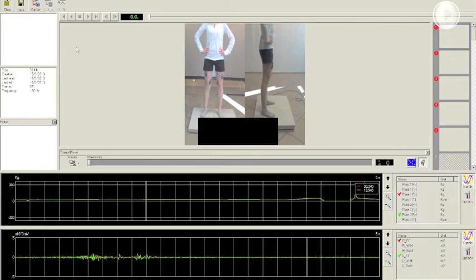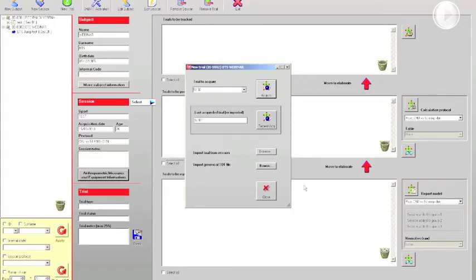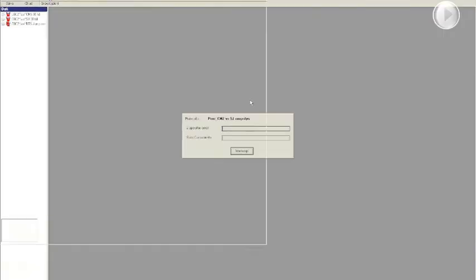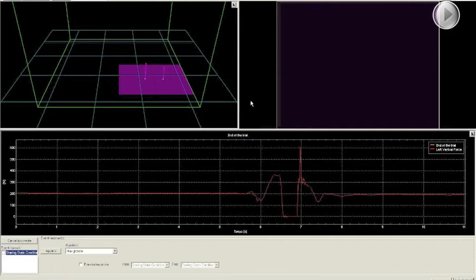And here we are. We close the tab to acquire new trials, and here you can see that we have our counter movement jump and our squat jump. Double clicking, of course we do not have to track the trial because we didn't acquire any kinematic data. We just need to click on calculation protocol. As in Smart Clinic, the software is going just to ask us to select some points in which we will need to select some events, but nothing else than this.